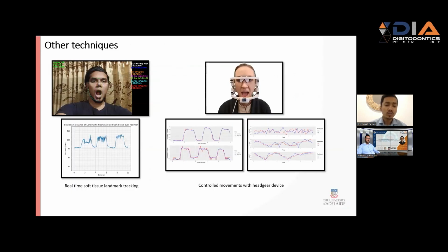Other techniques that we use are optic tracing, whereby we ask the participant to sit straight and do jaw functions, we ask them to speak, and we use different AI visions to see how their jaws are moving. It helps us create a non-invasive, non-contact method of evaluating whether they have anything that we need to further investigate. This is an incredible starting tool before we attach any kind of devices onto the patient. It reduces the level of apprehension and increases trust and confidence.